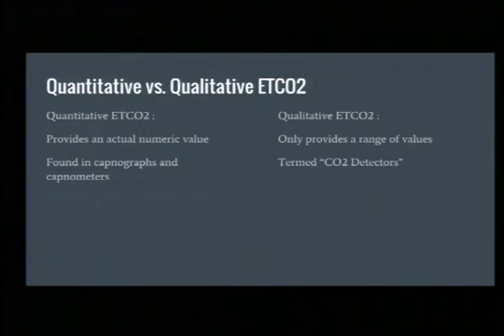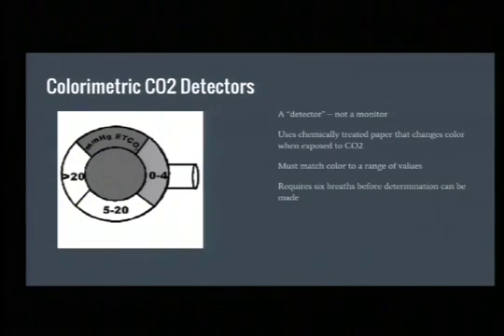We used to put it on after every tube. And they're termed the CO2 detectors. Is it there? Is it not, basically? And there were lots of false positives if you're in the esophagus for a short time, if there was food and all that stuff. So they were determined to not be as useful. It's a color change chemical that, when it's exposed to CO2, changes colors. It's kind of like a litmus paper type thought, but it's based on the CO2 exposure rather than a pH. And you need to make sure you have plenty of breaths in before you give a determination, because you can put it in the esophagus and get a little CO2 initially, and then after a few breaths, that'll disappear.